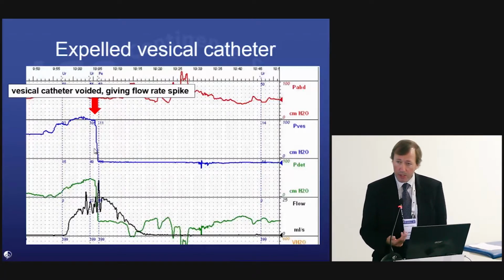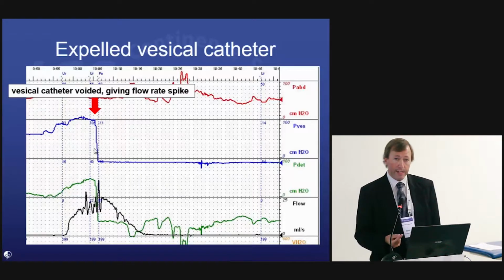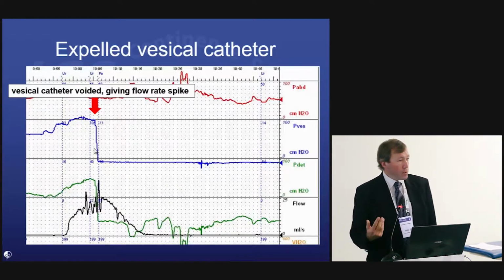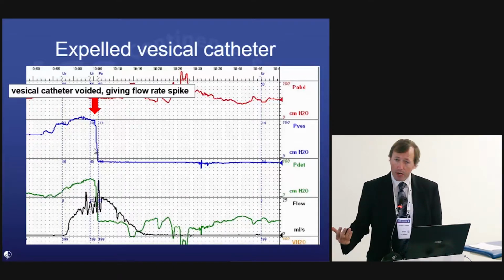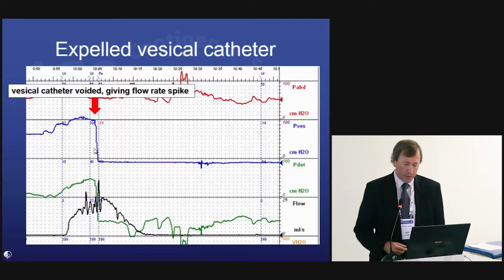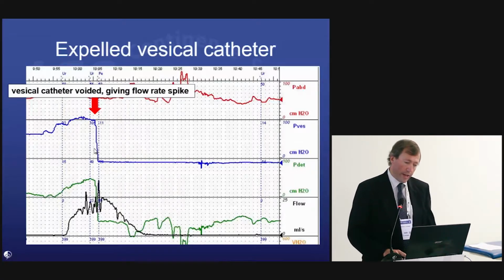Now in this case, I'd suggest that you might feel that the urodynamic question has been answered. You've got a good idea of what the detrusor pressure is, you can make a good estimate of maximum flow, and if that puts your patient definitely obstructed or clearly unobstructed, you probably would not need to do that test again. You could be confident that you have got an idea of their detrusor function or their urethral obstruction.